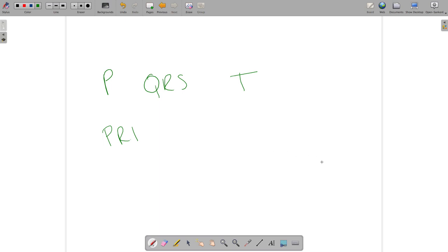All right, so what we've done in this video is we've talked a little bit about the components of the EKG to include the waves, P wave, QRS complex, and T waves. And we also mentioned the intervals, PR interval and the QT interval. We talked about two segments. The segments were the PR segment and the ST segment, and last but not least, we talked about the location of the J point. So we'll be looking at all those in the weeks ahead. Stay tuned.